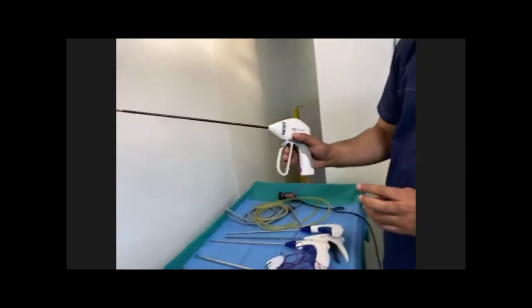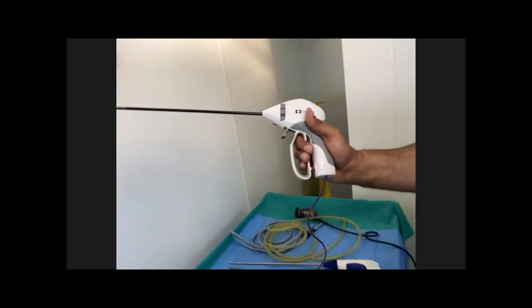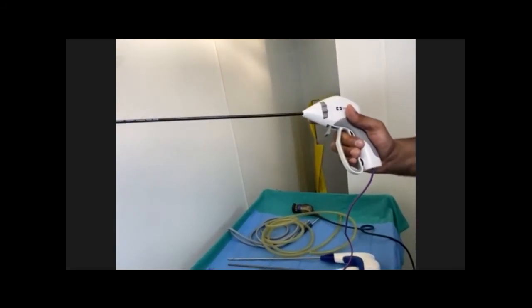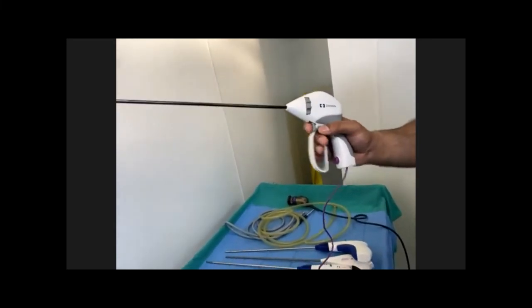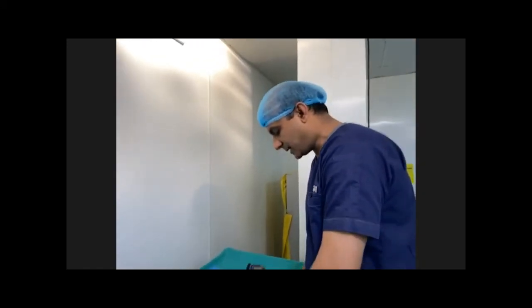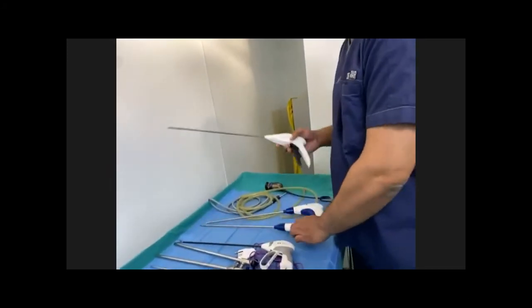From here, we can rotate it. This is the rotating knob. When we press it like this, it starts coagulation at the tip, and there is a special sound when the cycle is complete. We leave it and we cut it with this cutting knob. So this is LigaSure, and you will learn it more in the energy devices. So these are also important instruments, disposable.